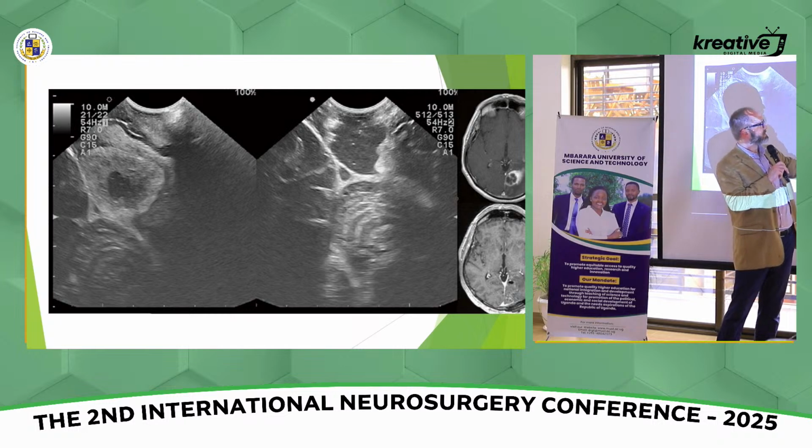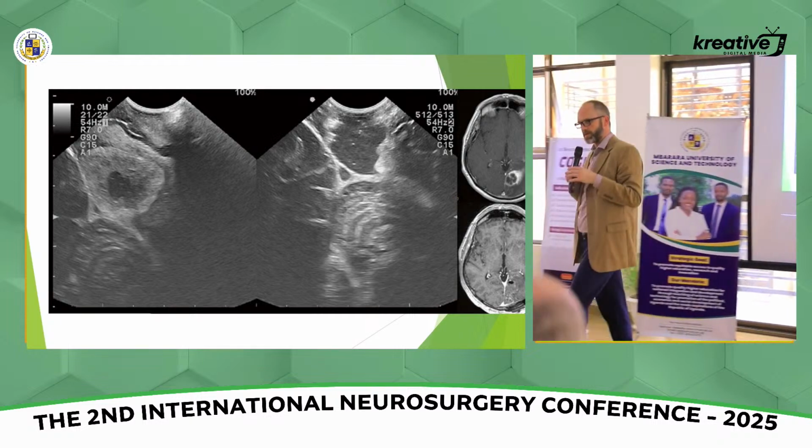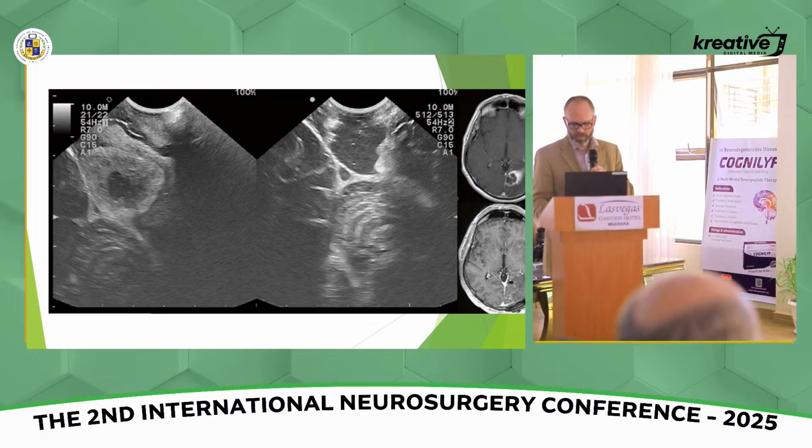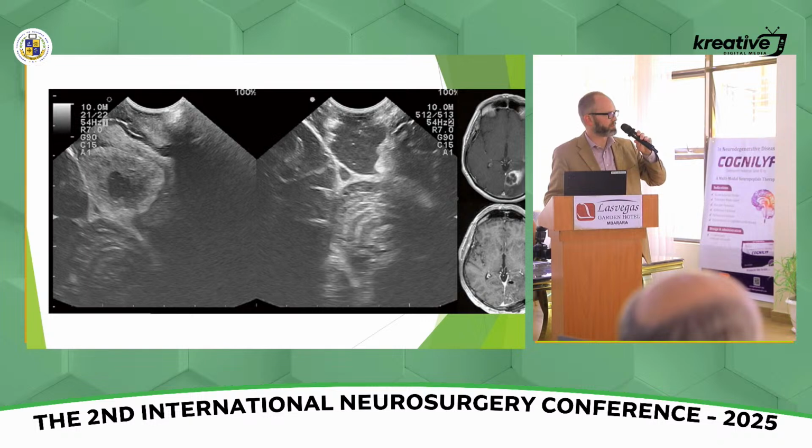All right, this is that edema that we saw at the beginning, which we know is not the tumor, right? And to the right just shows the preoperative and postoperative scan showing gross total resection.